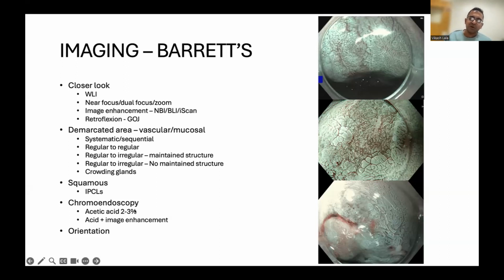And then just remember orientation, because that's important for not only you, not only your surgeon, who might need to take out the lesion, but also your pathologist. So you want to correctly orientate lesions. Now, orientation can be tricky. We talk about anal and oral, or proximal and distal, but we also talk about the clock face. Now, remember, the clock face is variable because you can easily bring 6 o'clock to 12 o'clock by rotating your scope. So you need a reference landmark.